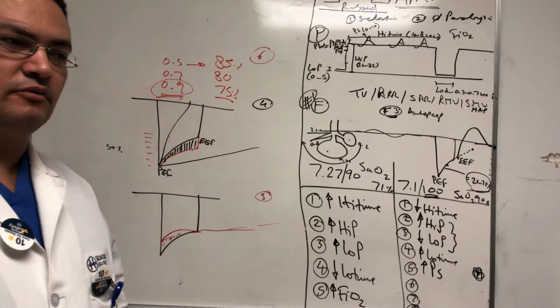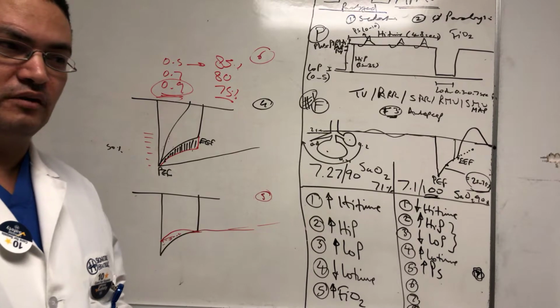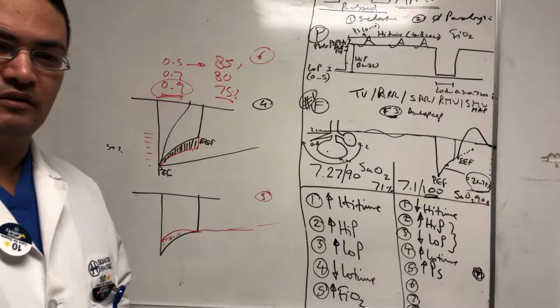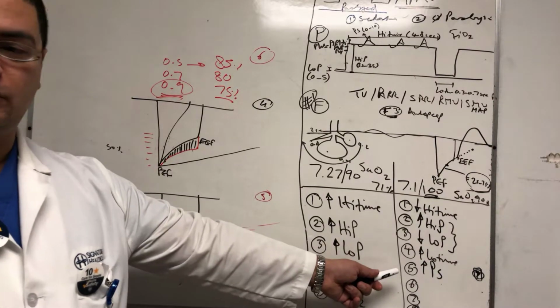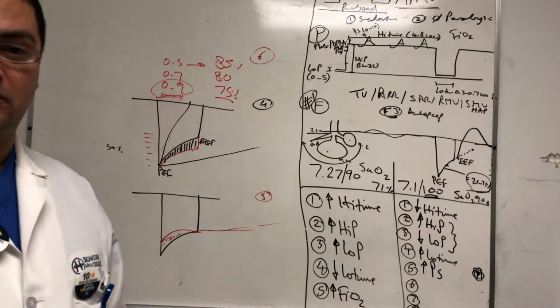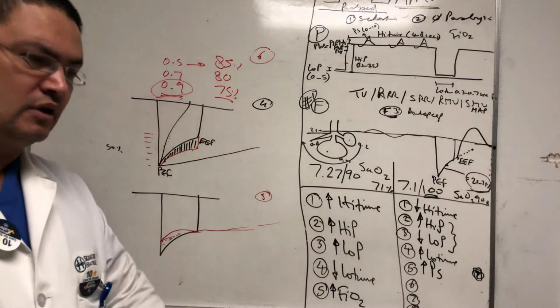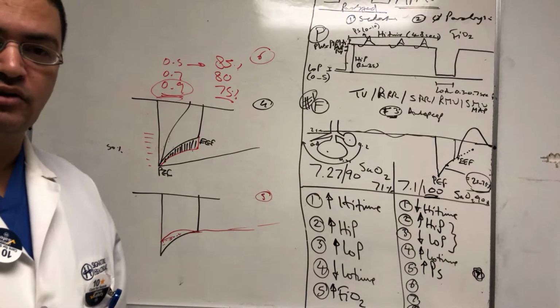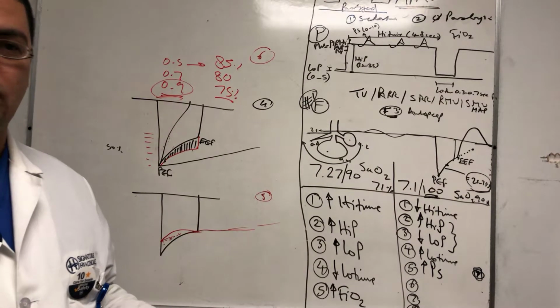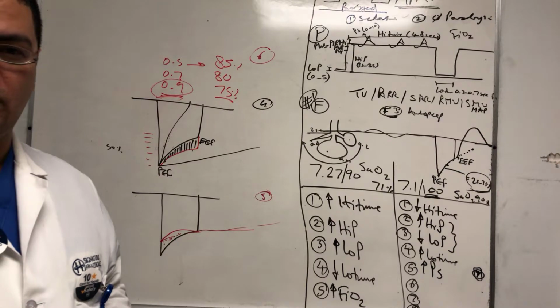Because we're afraid that if we add pressure support, we will negate that benefit. The negative breathing will switch into a positive breathing, and will negate that benefit. So that's why we're reluctant to put patients on pressure support. And every time you order this mode, you're probably ordering 0 pressure support. The only time we order some pressure support is if we are weaning the patient and the pressures are going so low, and the patient is complaining that there's no support, we'll give him some support to go through the weaning process.